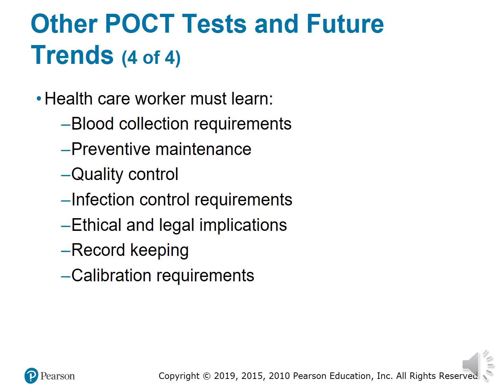Healthcare workers, when using POCT testing, must know how to collect blood for the required instrument. So they have to make sure that the blood collection requirement is adequate for the machine that they're using.